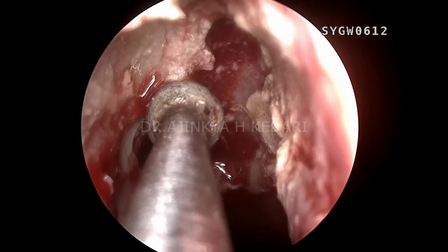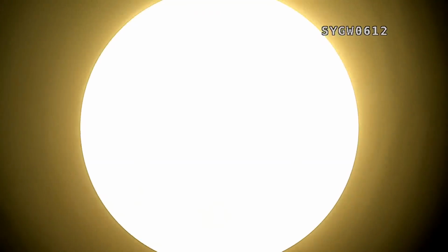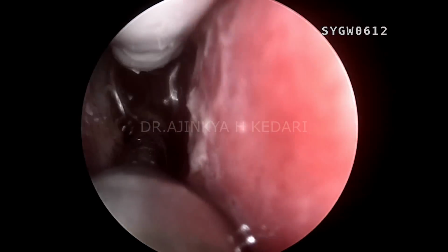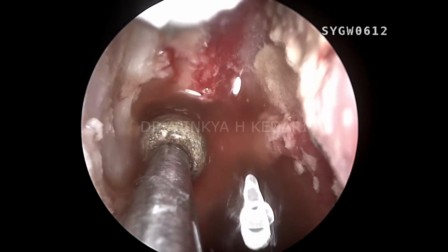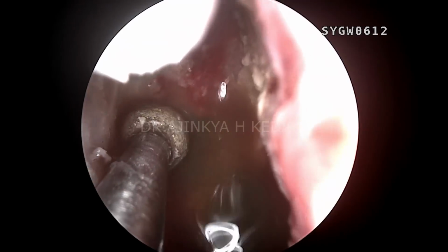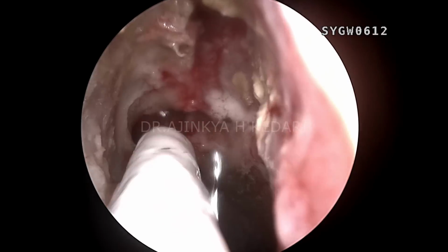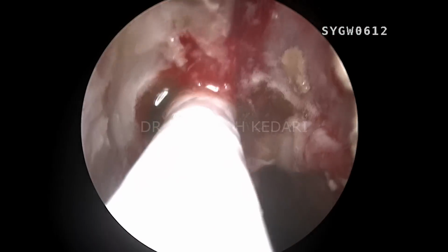You can see there's a high level DNS that is giving me a lot of issues here. It's a narrow space I'm walking in superiorly. So you can see I'm now trying to drill the bone which is most superiorly right now. You can use an angle shaft, 15-degree angle shaft for more feasible drilling inside. So you can see gradually, slowly we are opening up the patient's frontal sinus head on, the anterior wall basically.